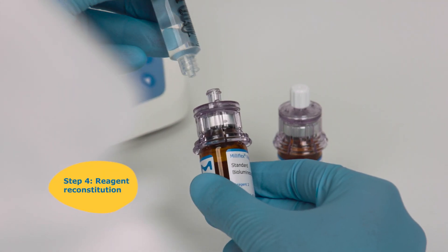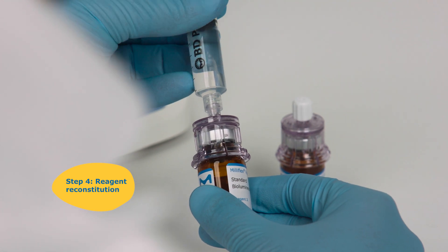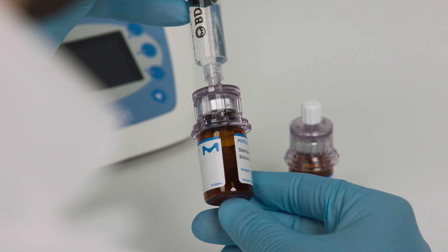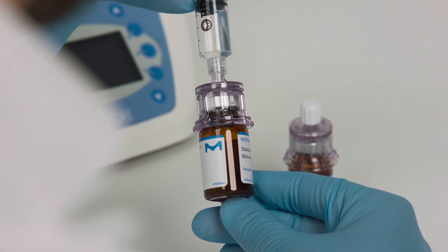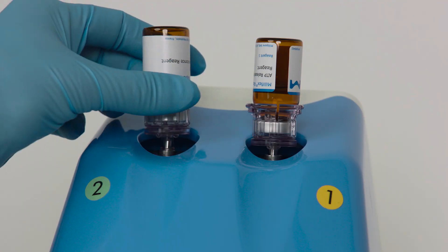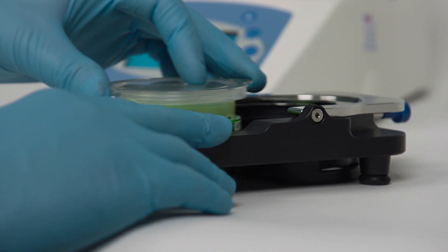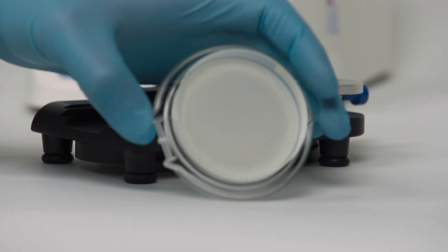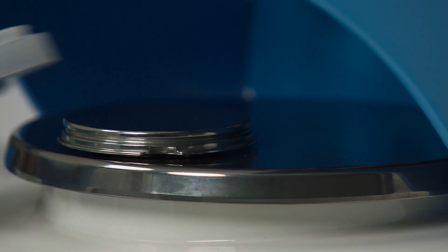To enable the enzymatic reaction that generates the bioluminescence where microbial cells are present, reconstitute the reagents and mount both reagent vials onto the Milliflex Rapid 2.0 autospray station. Separate the membrane filter from the agar plate using the membrane removal tool and place it into the autospray station.